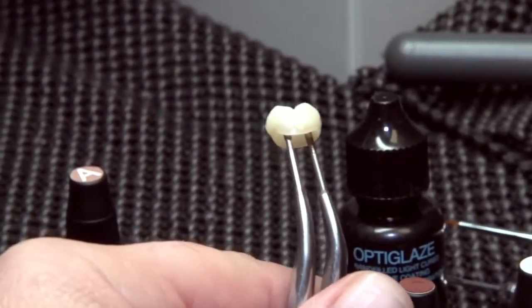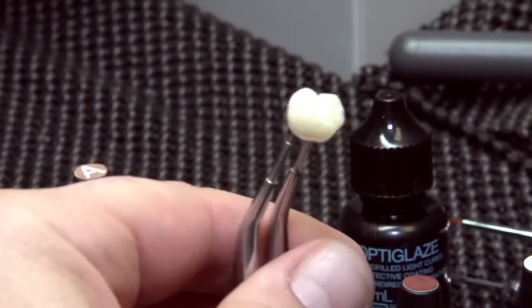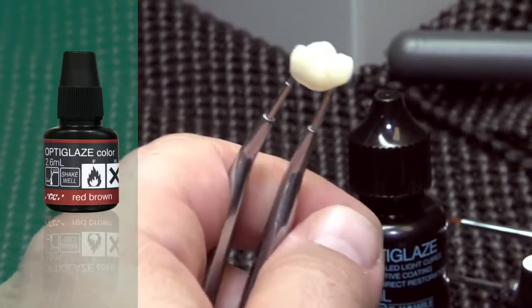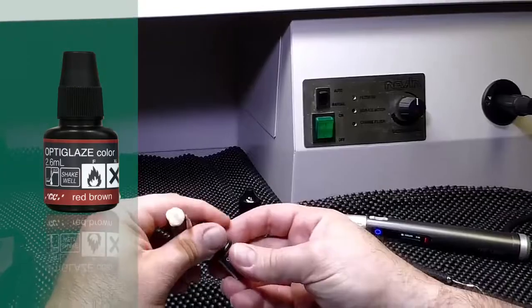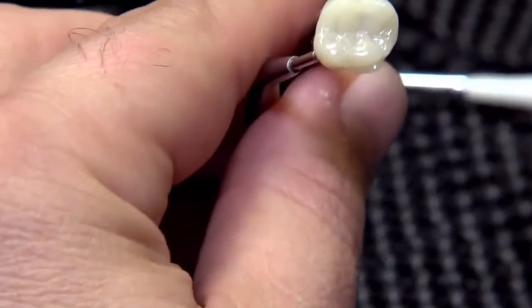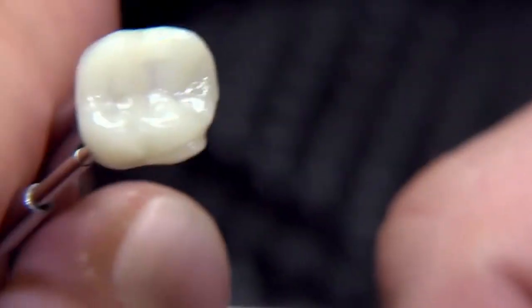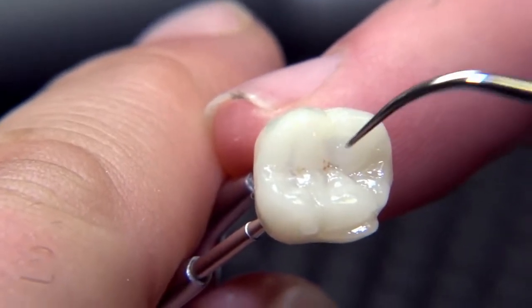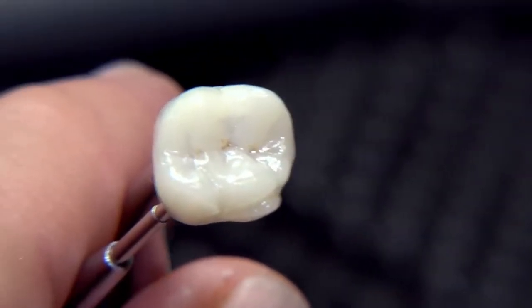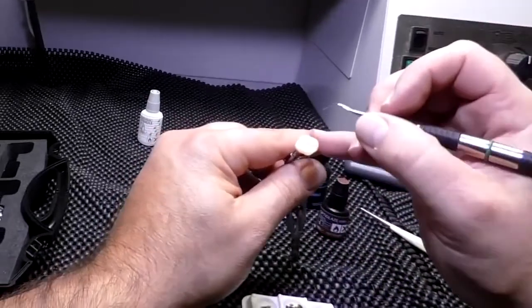Some may feel that's enough characterization, but we're going to go further and add stain within the pits and fissures to get that illusion of depth. We'll add red-brown for this specific crown. This color is very intense, so a little goes a long way. We take something like an explorer and lay a gentle amount. Anything that globs over or puddles, you can take your brush and feather that color out and dilute it so it's not too heavy — it's pretty easy to manipulate at this stage.